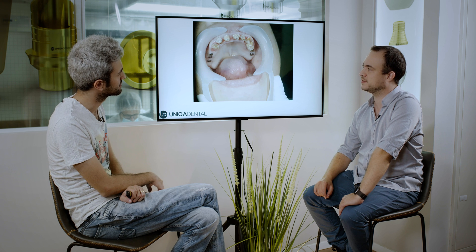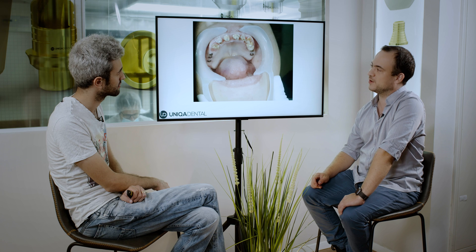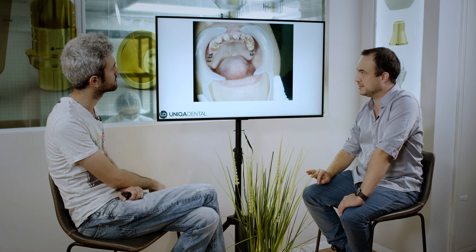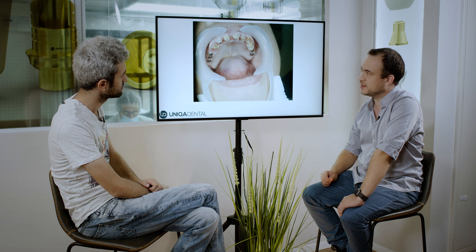These teeth are hopeless and you need to extract them all and make implants. Here you see the teeth after the removal of the bridge. You can also see she had a couple of short bridges in the posterior areas on multi-units — here on two implants, there on three. Those teeth had root canal treatment long before the previous bridge was made, and they had a post and core installed in the root canal for better fixation of the bridge.